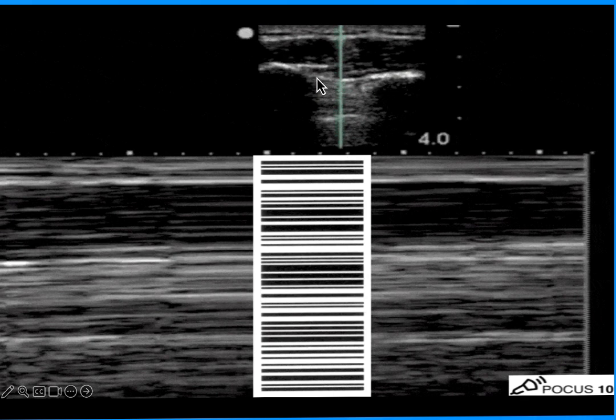We place it across the pleura, not on the rib. So right in the middle of that pleural line, we hit that button again, and it generates this motion artifact over time. So here we're getting nice, straight horizontal lines. If we look here, this is about 4 centimeters in depth. The pleural line is approximately 2 centimeters, which is roughly here.